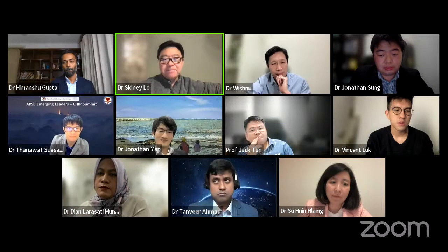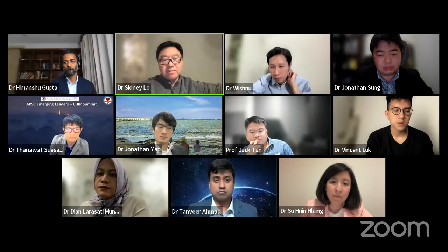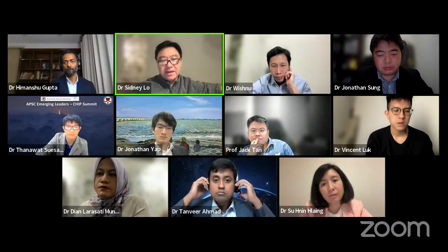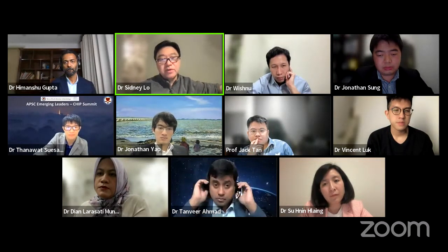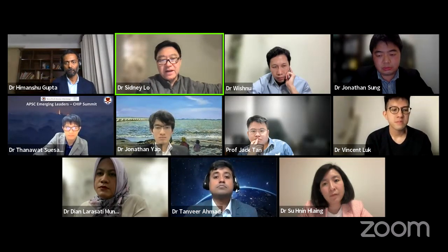And Mark Reisman came up with his in vitro study. And then we changed a little bit of the practice where smaller burrs we platform outside the patient at 180, 190,000 RPMs, expecting 10,000 less in the body. And the larger burrs that we were platforming at 160, expecting only 150,000 in the patient.